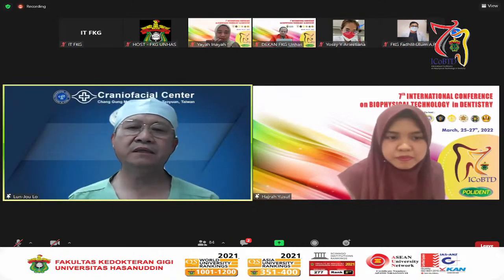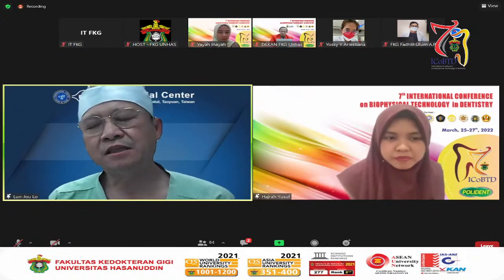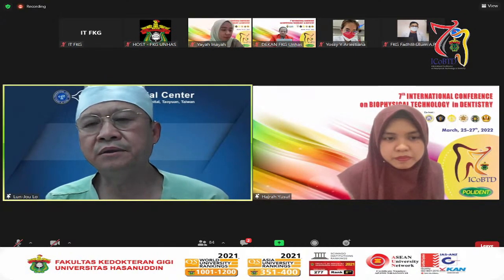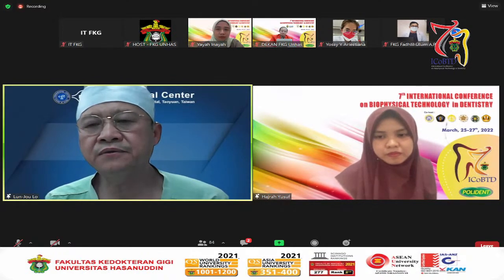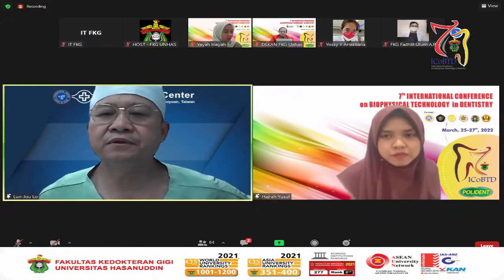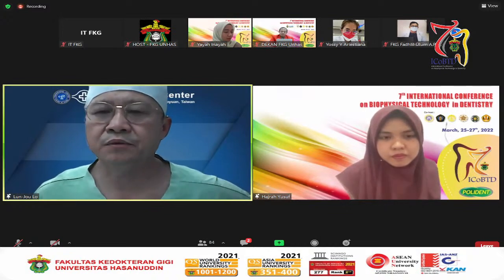And this has actually been very common in our practice, and certainly CBCT should be available in your school. So I think CBCT is quite useful. For 3D photo, there are several different machines that allow you to have a 3D photo, expensive or less expensive, and that is also helpful for evaluation, research, and planning as well.